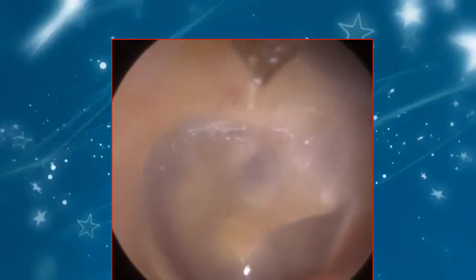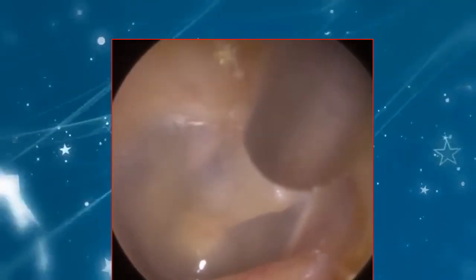Textbook eardrum, you can actually see the patient's incus there. I'm just going to mop up around the edge. So this is just where the cartilage portion is meeting the bony portion, so we can put a bit of pressure here. It's not going to cause the patient any symptoms. A bit of dead skin as well. A lovely light reflex. So actually here the endoscope is probably 2 centimetres away from the eardrum. We still get a lovely view. Just mopping up near the entrance here.